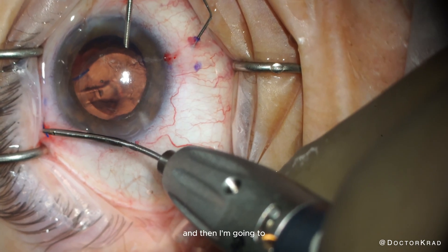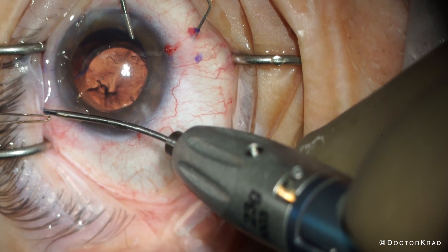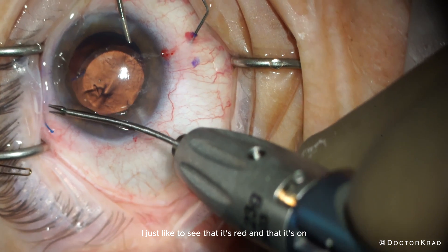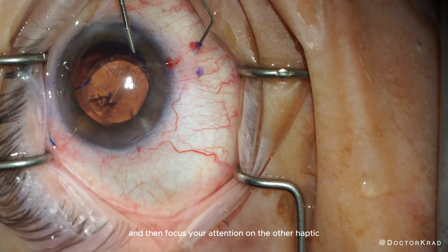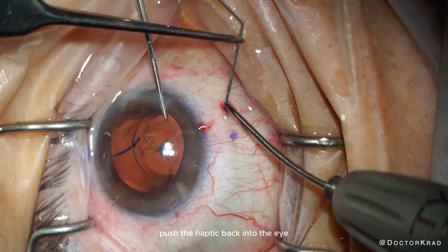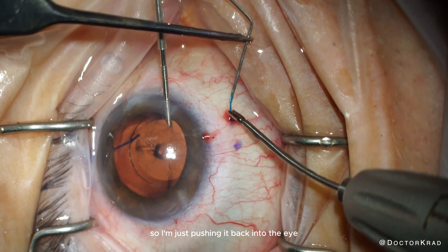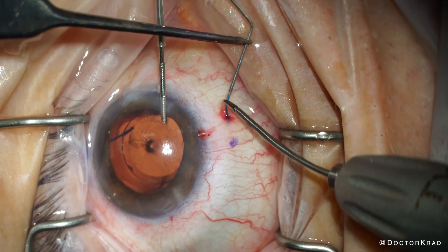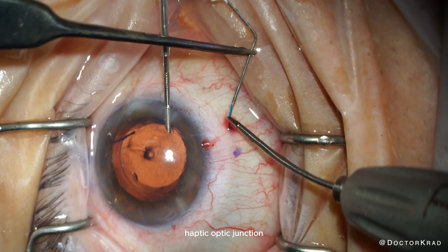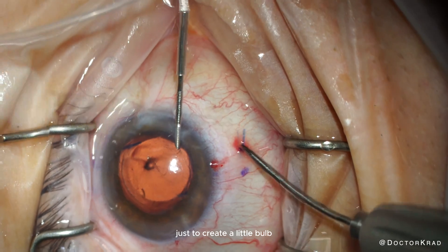Then I cauterize the tip to make a little bulb on this haptic — this is a low-temp cautery, though I think I prefer the higher temp; I just like to see it's red and on. You can let it go and then focus on the other haptic. As you pull out the needle, push the haptic back into the eye — you just need a little bit of the haptic exposed. I want to exert minimal force on the haptic-optic junction. Then cauterize the tip of this side as well to create a little bulb.